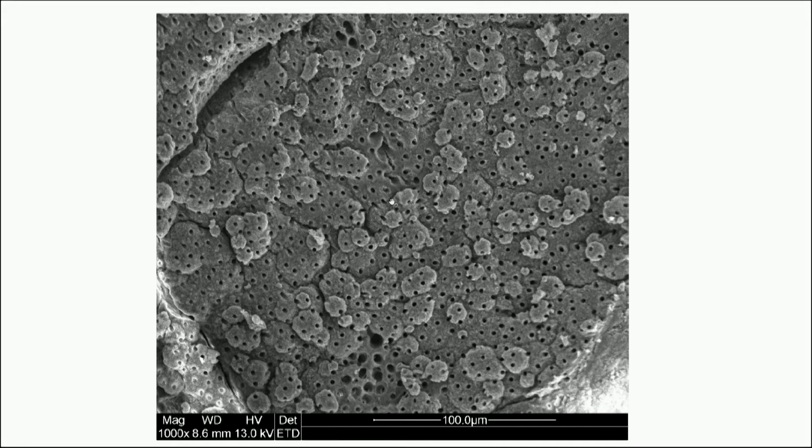What we found was really quite surprising. This is looking at the apical third. You can't see any of that material at all. All you can see is just the normal three-dimensional structure of the apical third with all those little tiny canals. And in fact, there's even the beginning of a small series of little micro canaliculi sitting over here. So it cleans it extremely well.